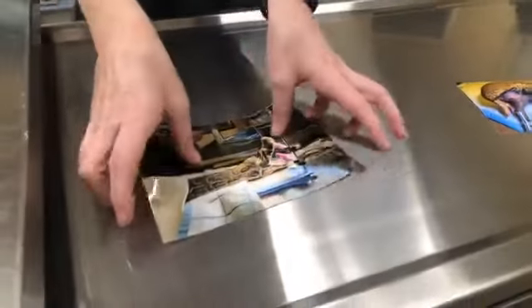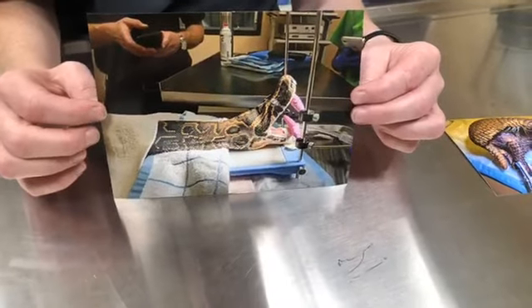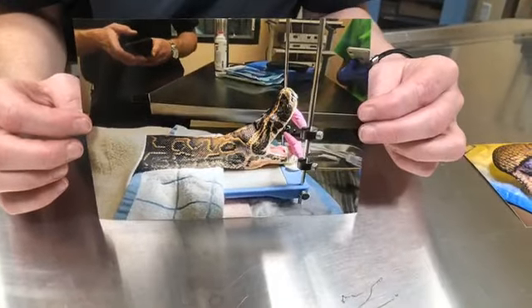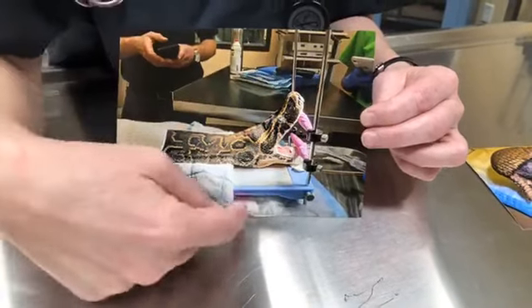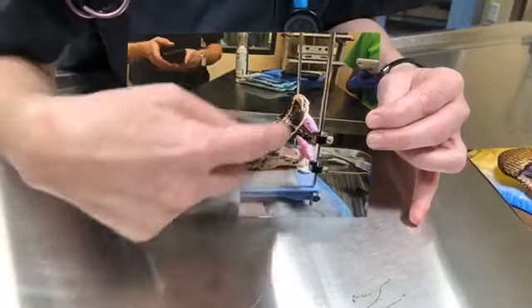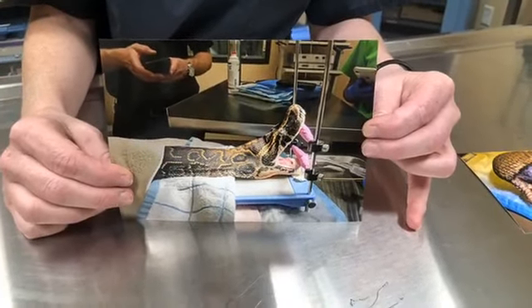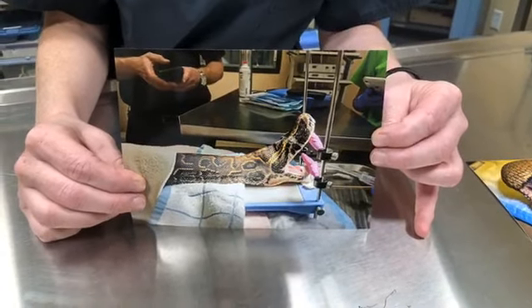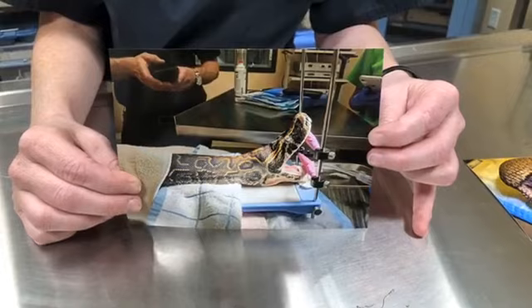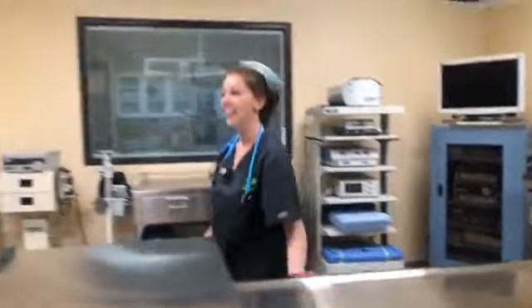And then here's another thing we did in this room. So this is one of our large pythons. And she had a mass in her mouth, so an oral mass. So we have this cool little contraption to hold her mouth open. You can see we padded it where it would be placed against her mouth so we don't injure her. And so we could hold her mouth open safely during surgery, and we removed the mass, and she's also doing great. So yeah, lots of good stuff here.